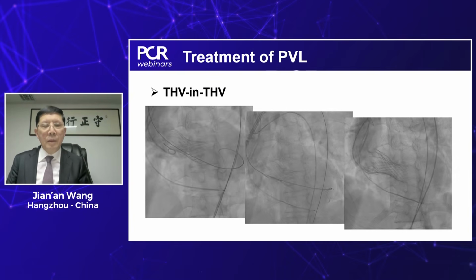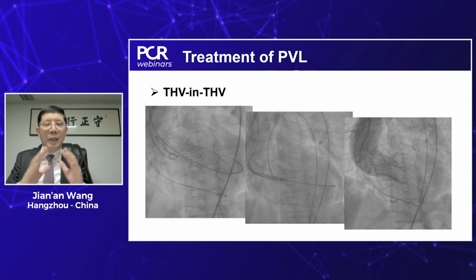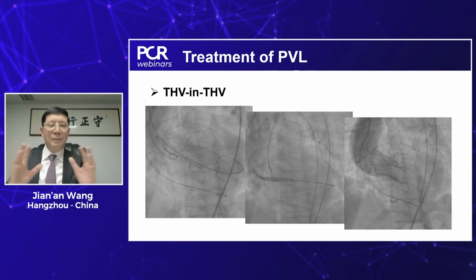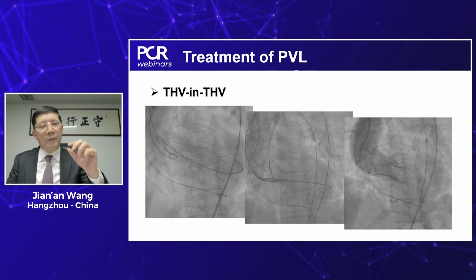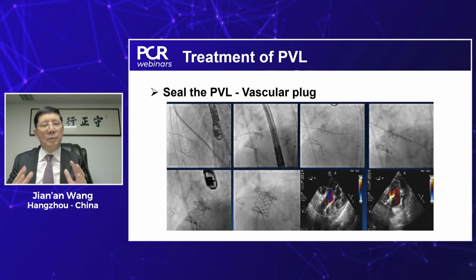Okay. So like the patient, initially we select a standard annular size device. Because the valve leaflet is very thick, sometimes in some patients calcification is not severe, but the leaflet is very thick and cannot open. So the leaflet can squeeze in, because the device is too big, can squeeze in the device down to the ventricle. So if you select the bigger size, you achieve a bigger orifice, you have a better PPM. So proper size is always the most important.